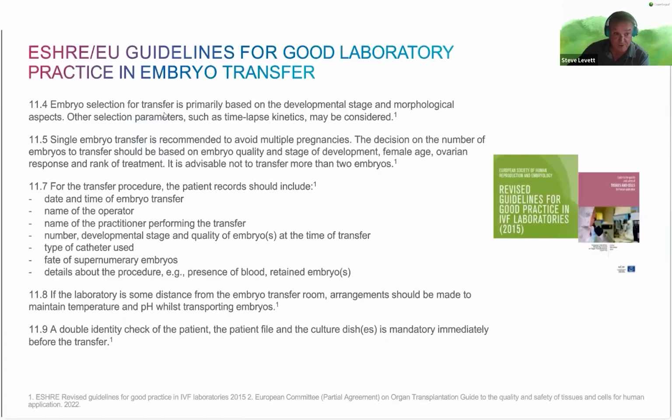But you'll see, if you just pick some of these points out, embryo selection for transfer is based on morphology, which most of you do. Then there are other selection parameters, including time lapse. It may be that we do genetic testing to isolate within a population the best embryo for transfer.